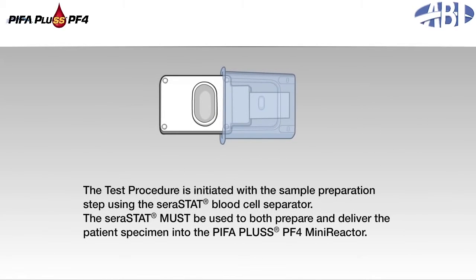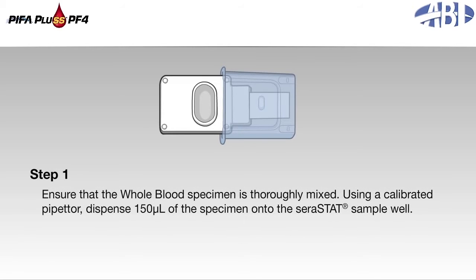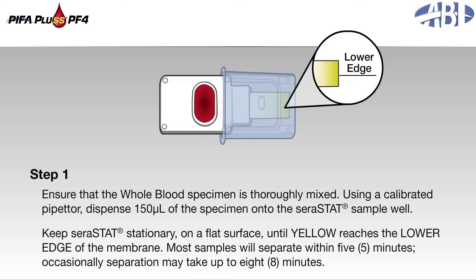The test procedure is initiated with the sample preparation step using the serastat blood cell separator. The serastat must be used to both prepare and deliver the patient's specimen into the PIFA Plus PF4 mini-reactor. Step 1: Ensure that the whole blood specimen is thoroughly mixed. Using a calibrated pipetter, dispense 150 microliters of the specimen onto the serastat sample well. Keep the serastat stationary on a flat surface until yellow reaches the lower edge of the membrane. Most samples will separate within 5 minutes; occasionally, separation may take up to 8 minutes.